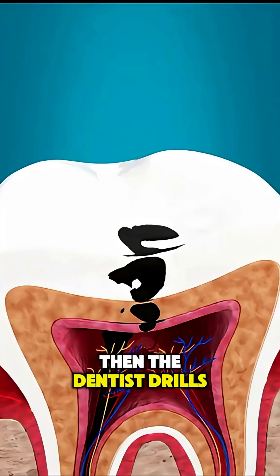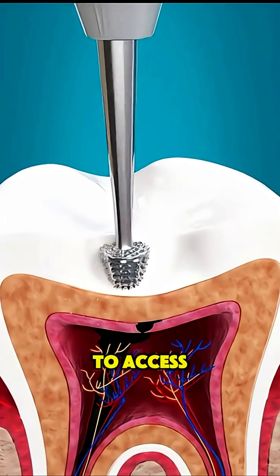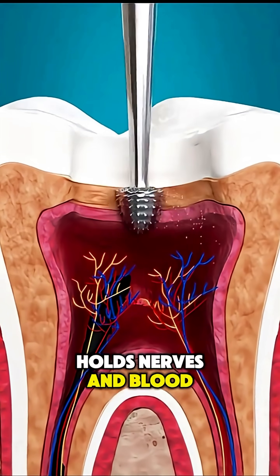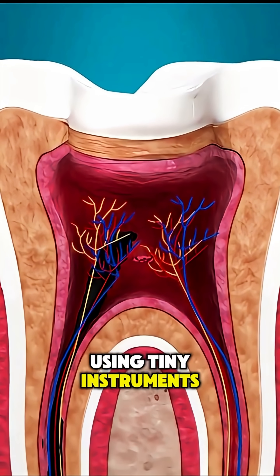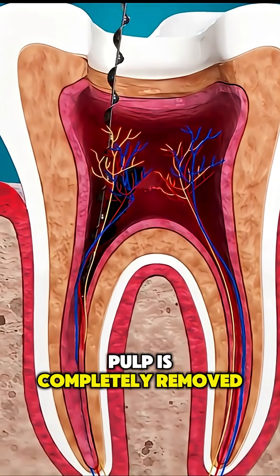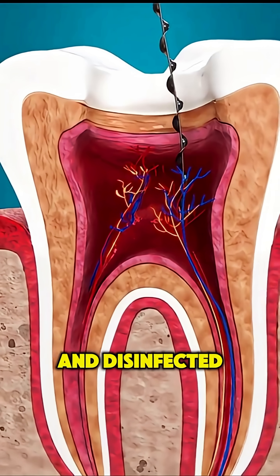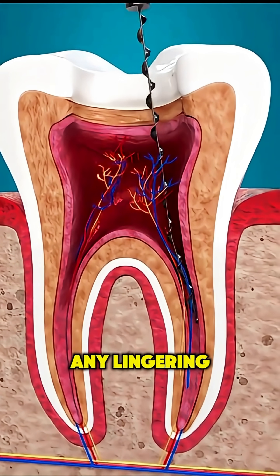Then the dentist drills a small hole through the top of the tooth to access the pulp chamber, the space inside that holds nerves and blood vessels. Using tiny instruments, the infected or dead pulp is completely removed. The root canals are then carefully cleaned, shaped, and disinfected to eliminate any lingering bacteria.